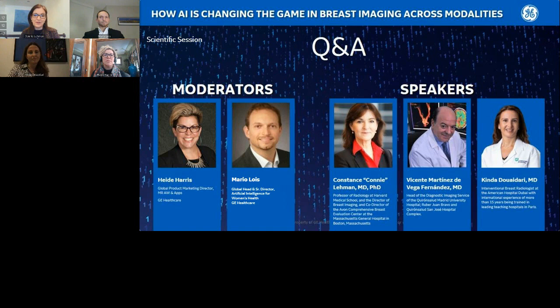And then at the next level, just as you've said, would there be a subset that are so highly likely to be negative or without anything that a human would recall, that you could allow that to be a subset of screening cases with a very specific use that would be read by the AI algorithm alone? And we'll all remember, we have a lot of problems to address.